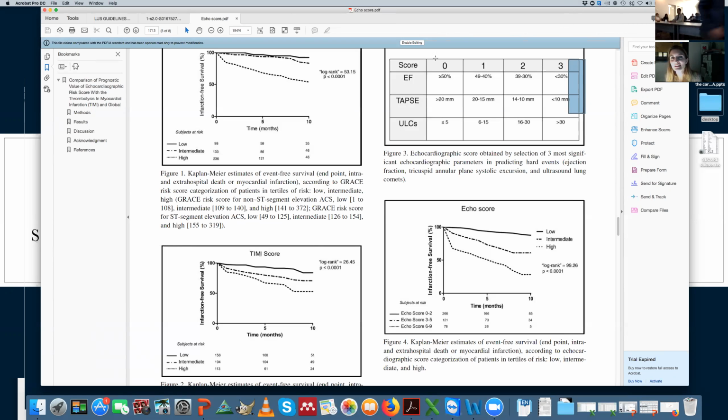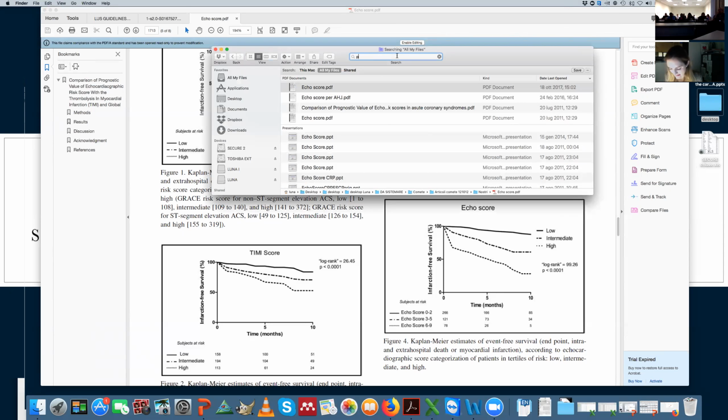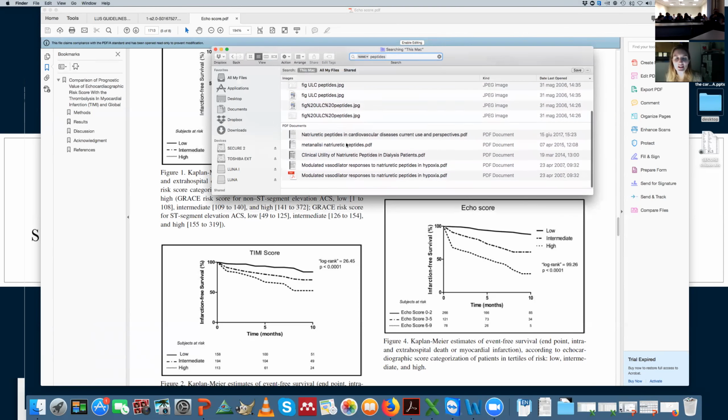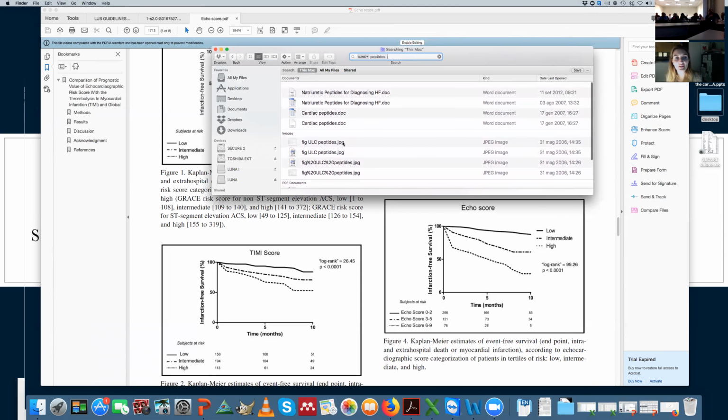Okay. Yeah, that's it. Does it correlate linearly with biomarkers, heart failure or ischemia? The BNP and so on. The BNP or troponins or CKMB. Does it correlate? Yes, this is another important question. And the answer is similar. So it is yes.